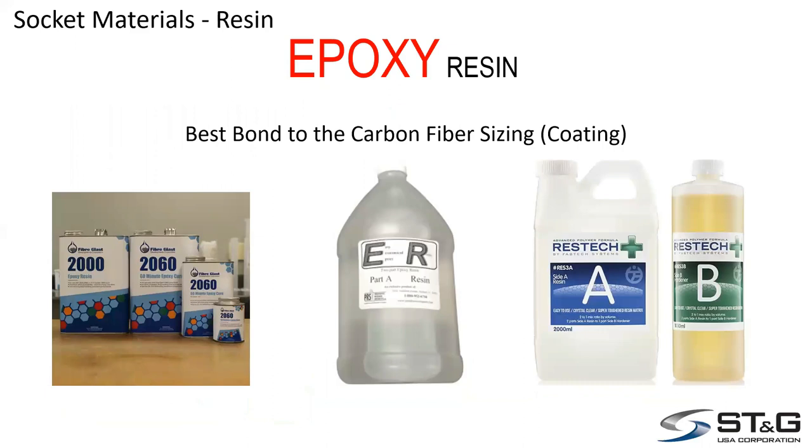The type of resin you use really depends on what you're familiar with and what you like. These are just some random shots of resin. I've used ResTech and the ER resin, which is readily available to us. And of course, as you get into the higher quality side of resins, from polyester going up to epoxy, your cost is going to be more because of the resin quality. But always check your MSDS sheet. If it says polyester, then you may not be getting an epoxy.